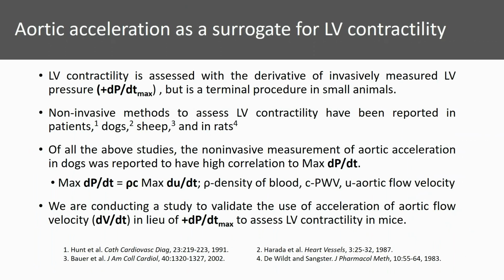Dr. Reddy? Thank you, Tanya. We all know that the first derivative of left ventricular pressure is considered a gold standard to determine cardiac contractility. But again, pressure is invasive, and so over the years, attempts have been made to develop non-invasive methods to determine or estimate LV contractility. Here I mention a few studies. It was reported in patients, dogs, sheep, and rats. There may be other studies as well.